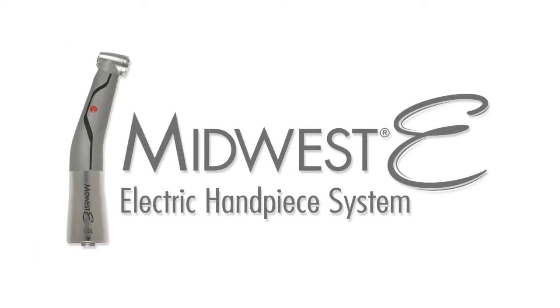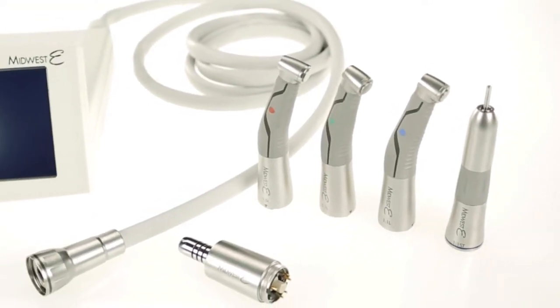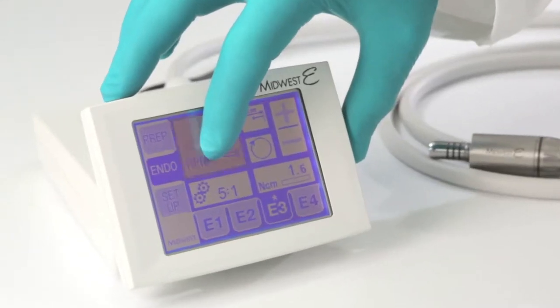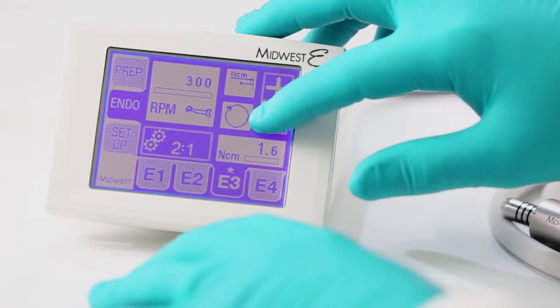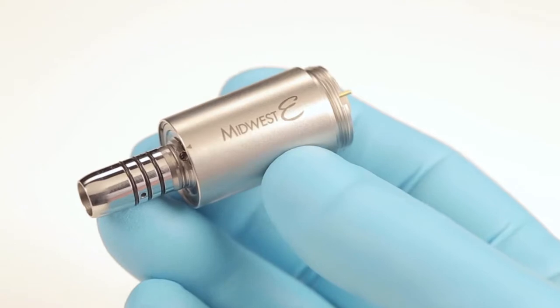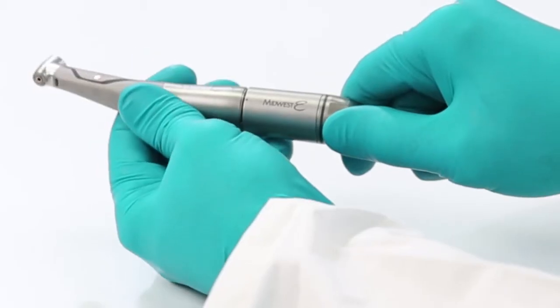Thank you for purchasing the Midwest E electric handpiece system. We are glad that you chose to invest in this product and hope that you enjoy many years of service from it. This short video is provided to give you a general overview of this system as an introduction. Please read the directions for use provided in the Midwest E packaging prior to use on patients.